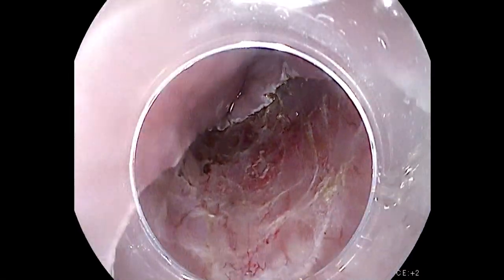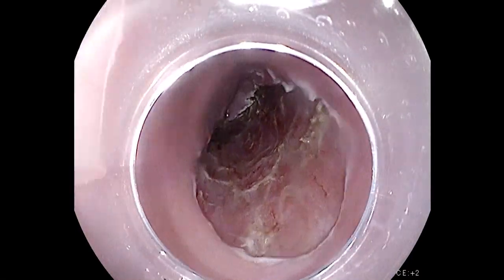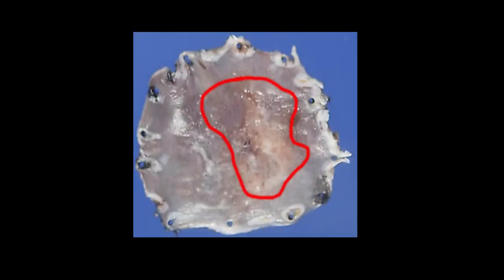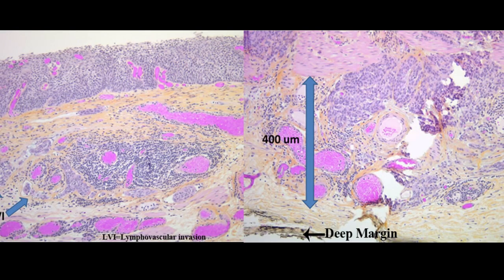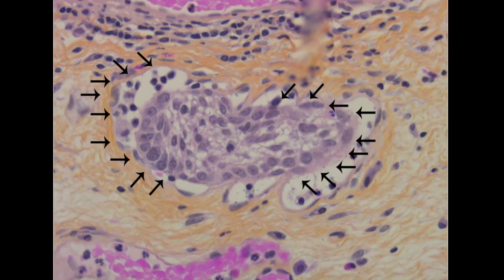Here we can see the final defect post-ESD. Here is the gross specimen, with the depressed area containing the B2 vessels and reticular pattern outlined in red. Here we can see the corresponding pathology demonstrating SM2 moderate to poorly differentiated squamous cell carcinoma. Under high power, we can also see lymphovascular invasion.